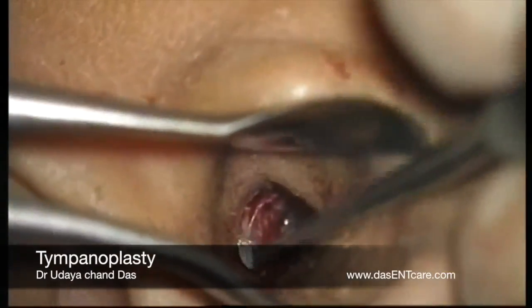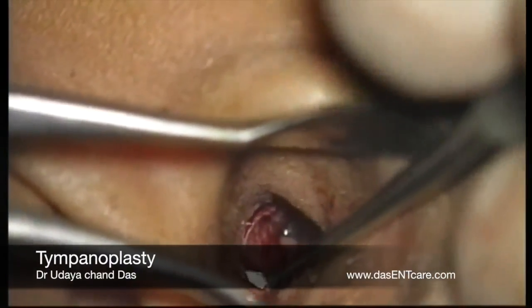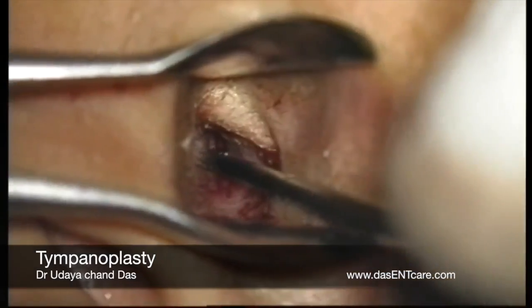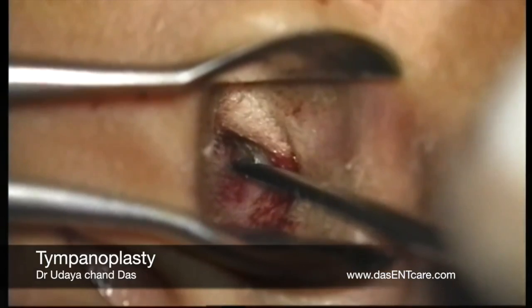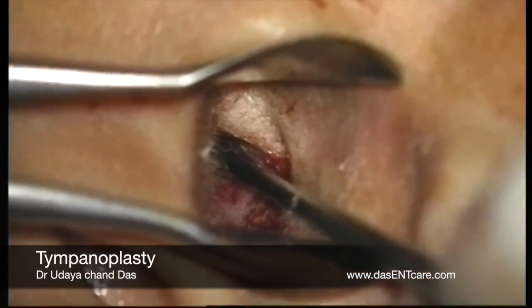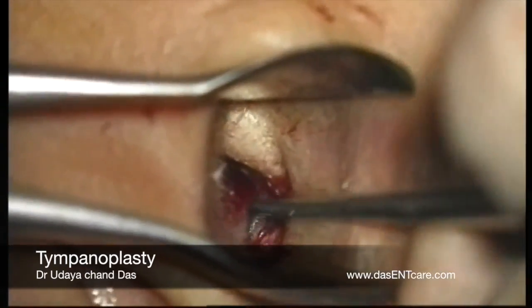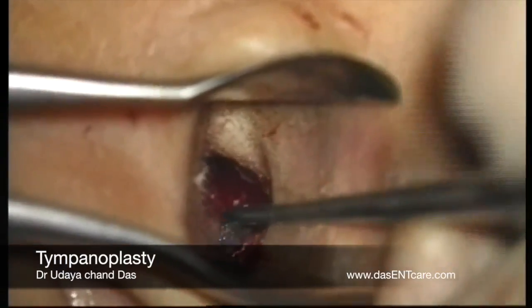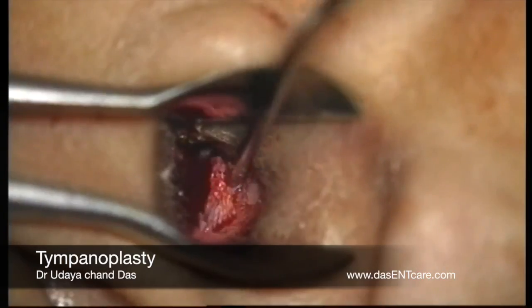This is the ear canal which has been infiltrated with xylocaine and adrenaline, and then the canal incisions are given. The incision started from 12 o'clock to 6 o'clock position, about 5 millimeters away from the tympanic membrane. Then two vertical incisions, one at 6 o'clock connected to the first incision and the other at 12 o'clock.